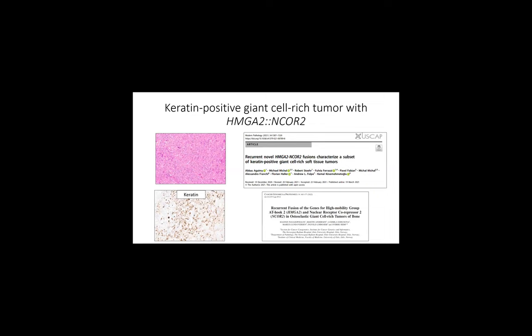And my suspicion is that we've called a lot of these giant cell tumors of bone in the past because the morphology is so similar. So I've been doing keratins on my giant cell rich tumors. And again, that's how I've been recognizing this entity.